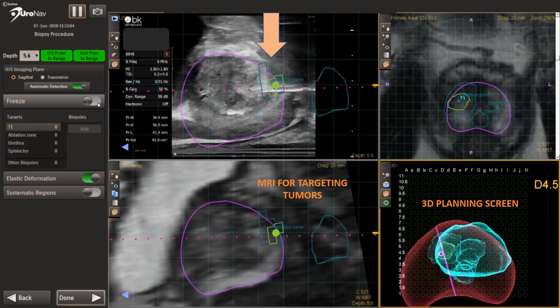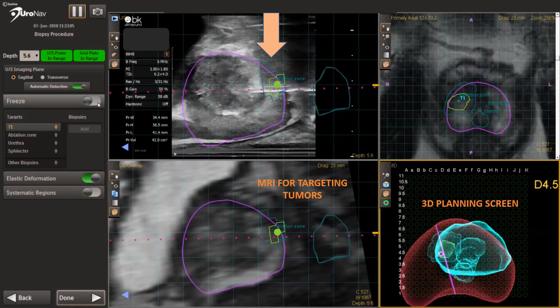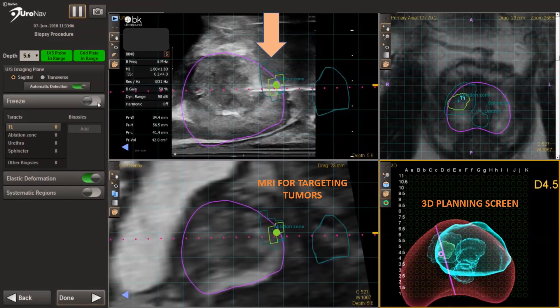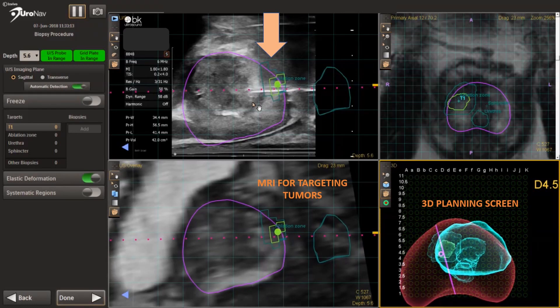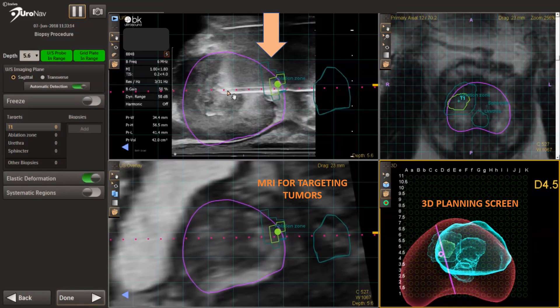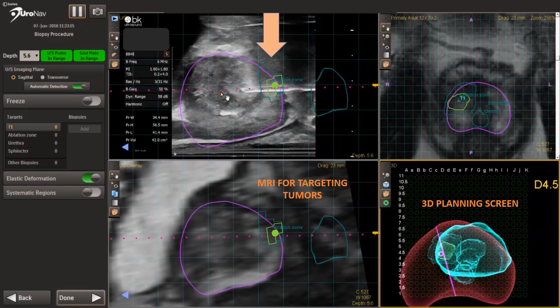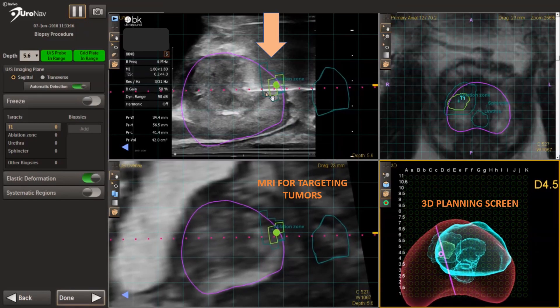The orange arrow is pointing at the actions that are happening right now. In the lower right-hand corner of your screen is the 3D planning. We're able to outline the urinary sphincter, the urethra, as well as our intended area of ablation.